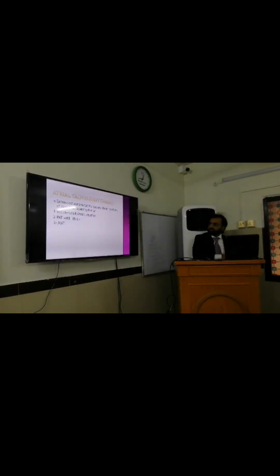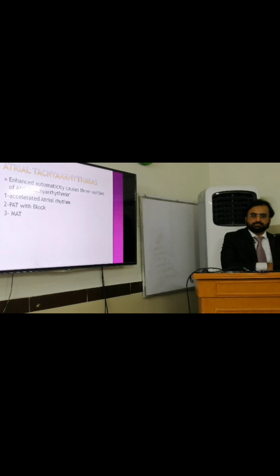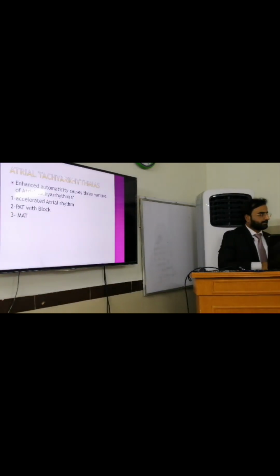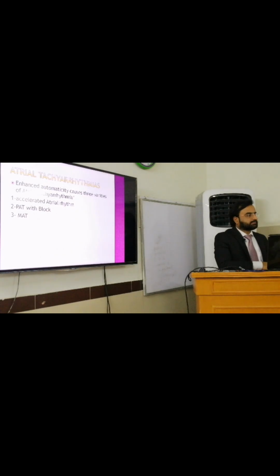As this topic suggests, enhanced automaticity causes three varieties of atrial tachyarrhythmias. One is the accelerated atrial rhythm, second is paroxysmal atrial tachycardia with block, and third is the multifocal atrial tachycardia, right? As I said, with atrial tachyarrhythmias, as the term suggests, the rhythm arises from the atria.